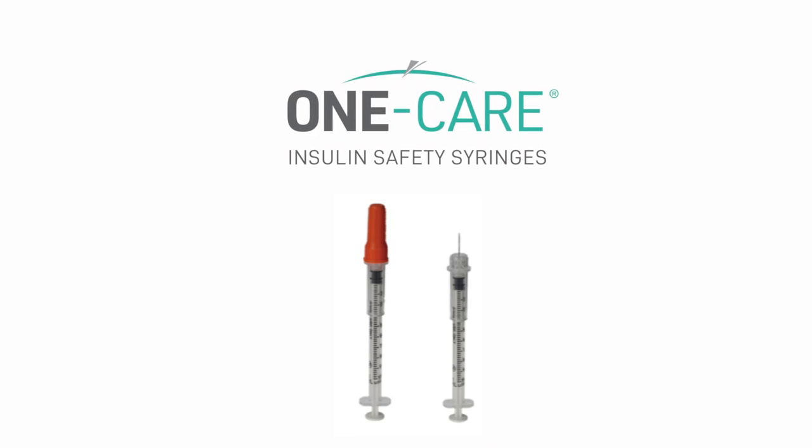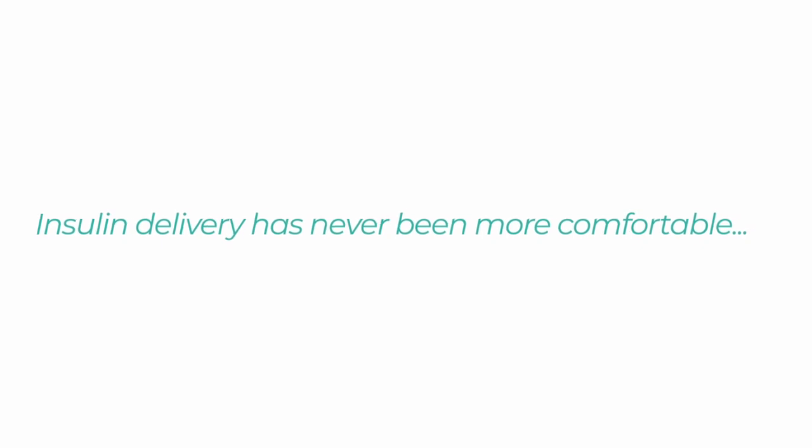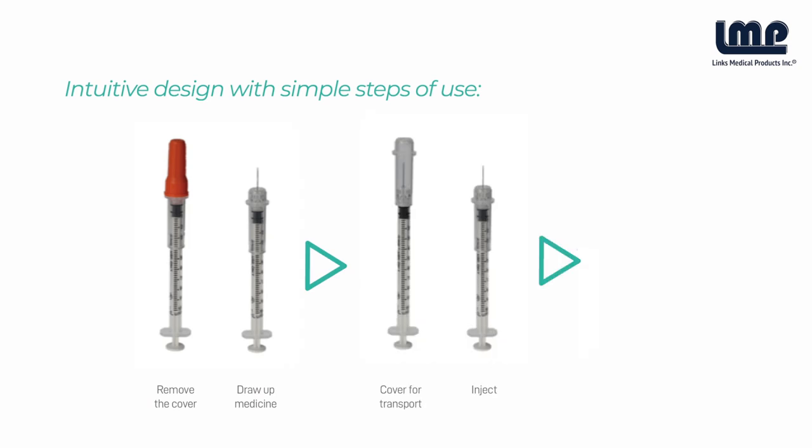One Care Safety Syringes are easy to use and help reduce the risk of accidental needle sticks. One Care Safety Syringes reflect a design that's been widely used by healthcare professionals for many years, so they understand how to use this proven technology.